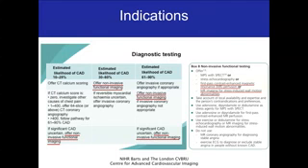In the very low risk population, the guidance suggests to do a coronary CT calcium score. Now, if this comes up with any suggestion that there may be coronary artery disease, then a non-invasive functional imaging test should be offered. And now we're talking about cardiac MR imaging with either first pass contrast magnetic resonance perfusion, or alternatively MR imaging for stress-induced wall motion abnormalities.